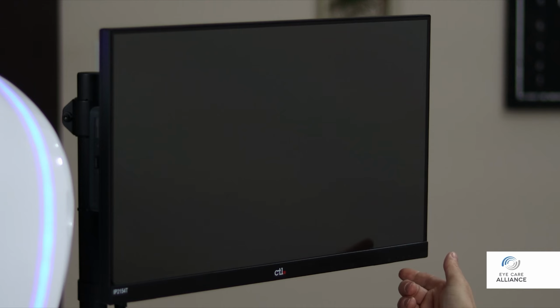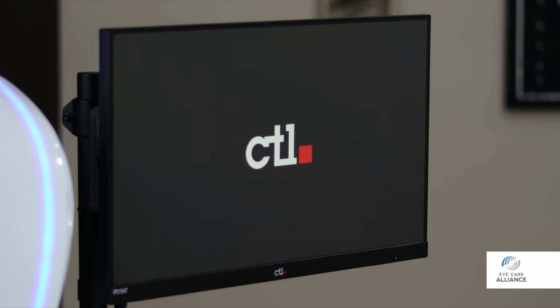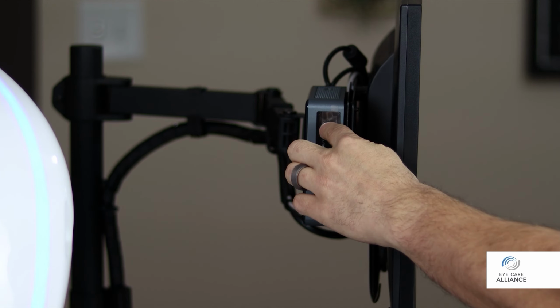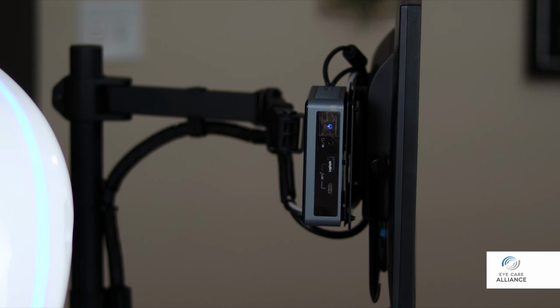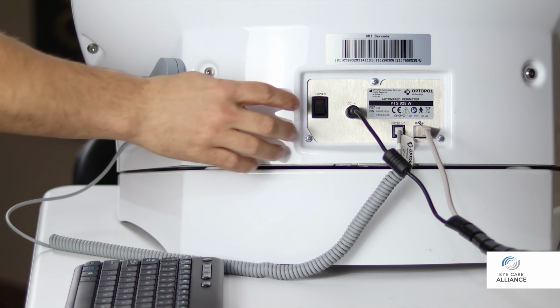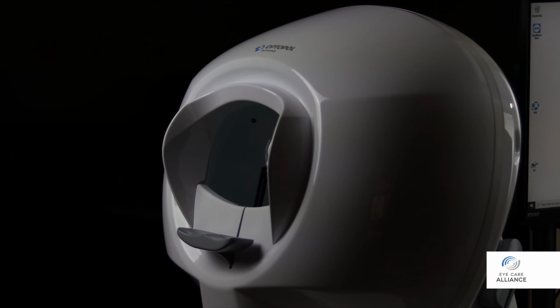The monitor has a touch-sensitive power button at the lower right corner. The PC is turned on by briefly pressing the power button. This will illuminate blue when turned on. On the back side of the instrument, near the power input, you will find the power switch. A blue band will illuminate when flipped on, and the startup process will begin.